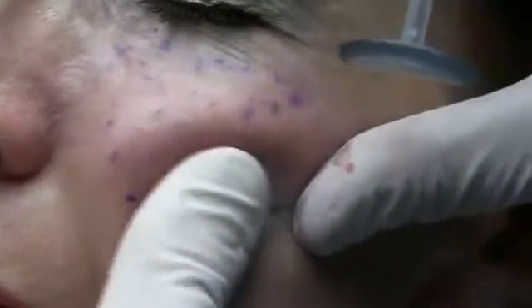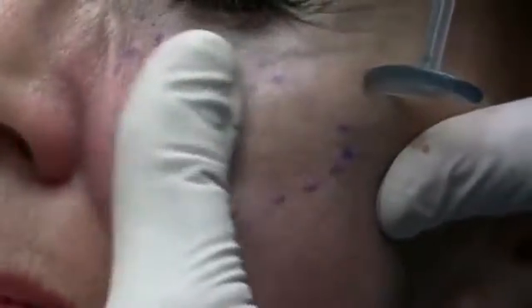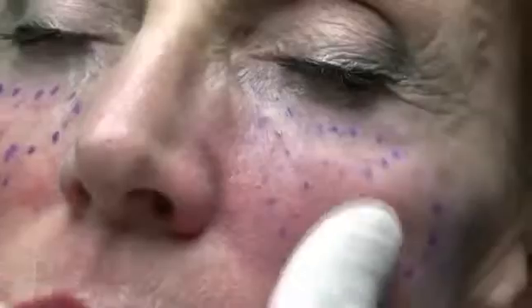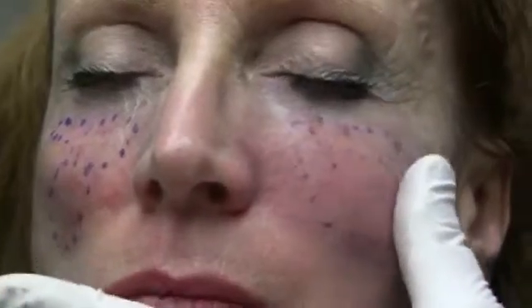And if you ever look at a cheek implant, this is about the exact shape of it. And what we're going to do is just add some filler here. And when you have a patient that will purchase the sufficient amount of filler to do a job, it is amazing what you can do with filler. And I'm not a proponent of, quote, liquid facelifts because I think it's a very expensive short-term fix.